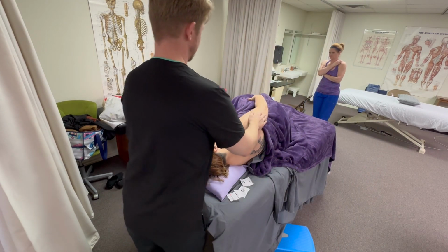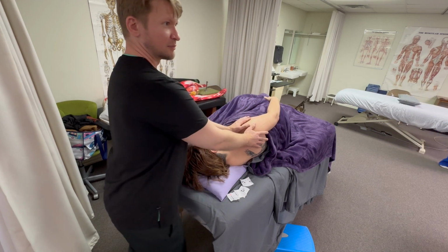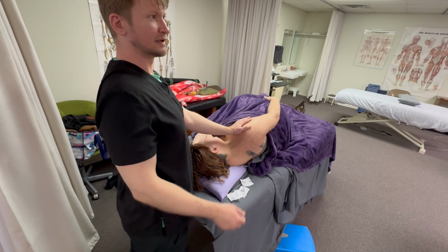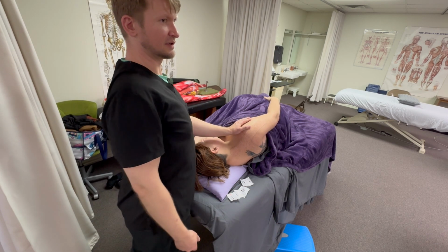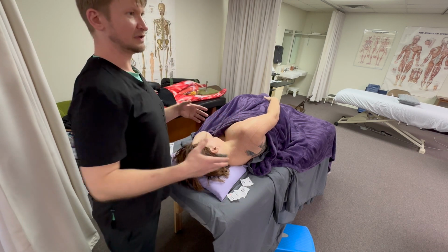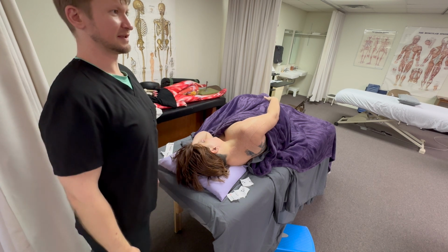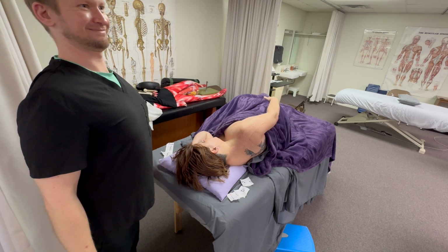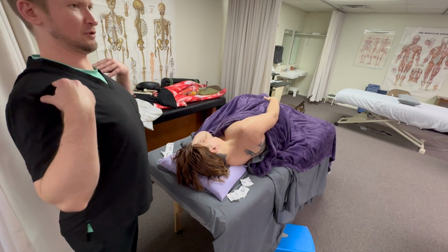So make sure she's good and pinned. So just a little bit is fine. There, that's what I need, is more of a rolling back like this. She doesn't need it to be this. Just has to go from here to here. With this one, I think about putting a person in just the most ideal posture possible. So I try to just get them, is this good posture? Like, this is too much, but shoulders back, rolled back, okay?